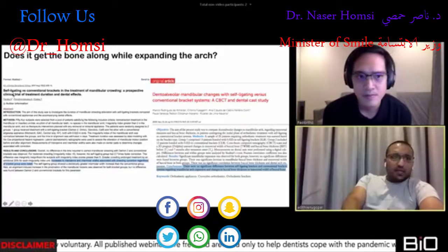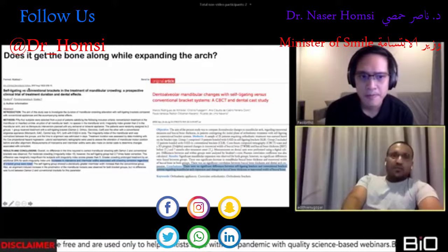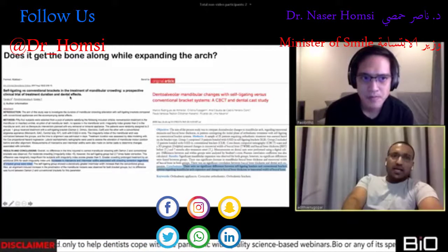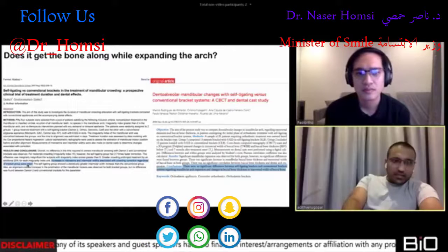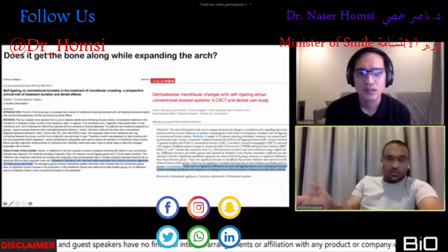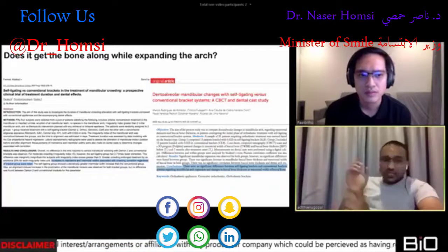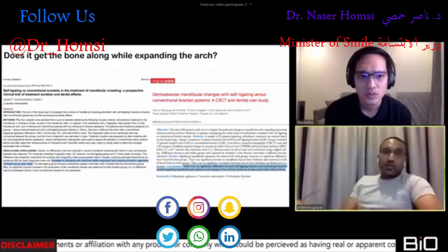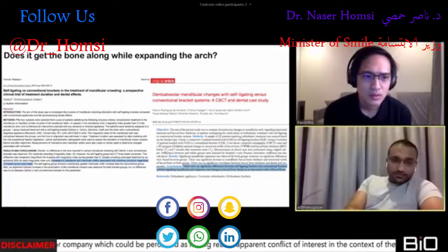Now, this very interesting paper by Dr. Eliades again, self-ligation versus conventional brackets in the treatment of mandibular crowding, a prospective clinical trial of treatment duration and dental effects. The results were that increased widths associated with crowding correction were noted regardless of bracket group. So that means, as I've mentioned, both groups showed an increase in intercanine width. The self-ligating group showed a statistically greater intermolar width increase than the conventional group.